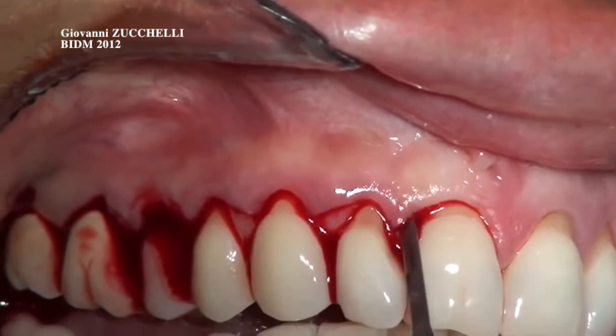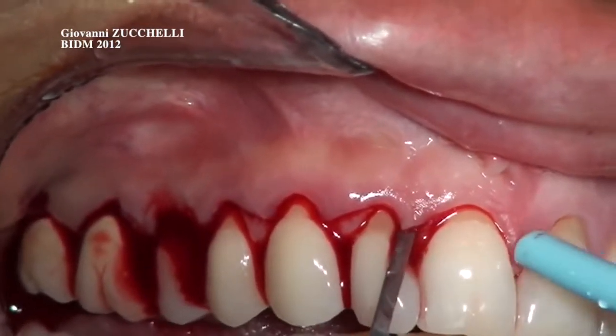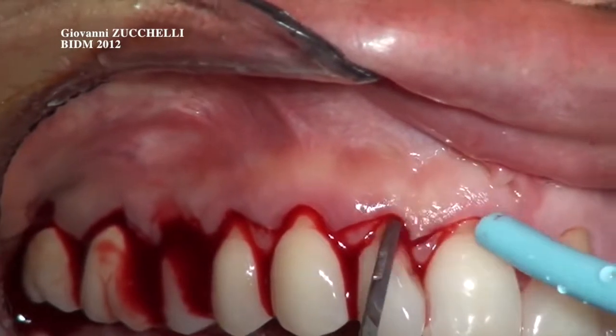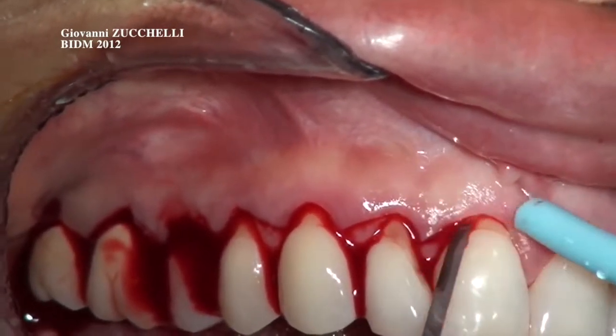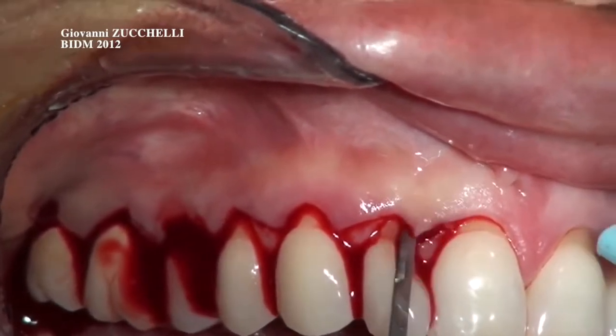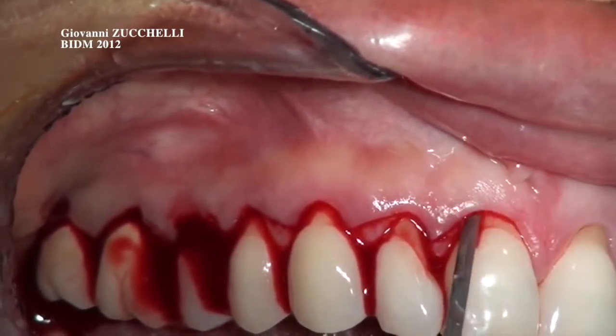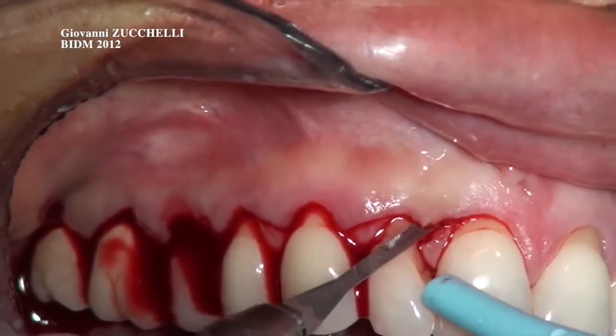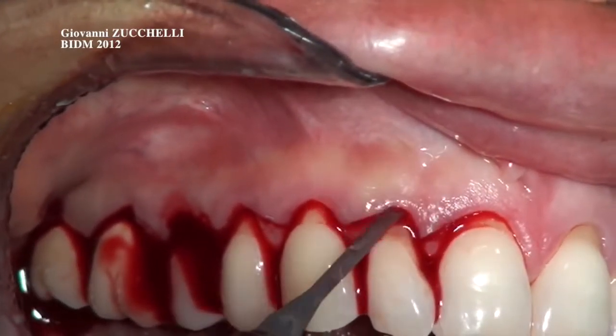Until the tip of the papilla is above my knife. You can see now the tip is here, and so I can make a horizontal incision, keeping all the surgical papilla the same split thickness. 1 and 2.